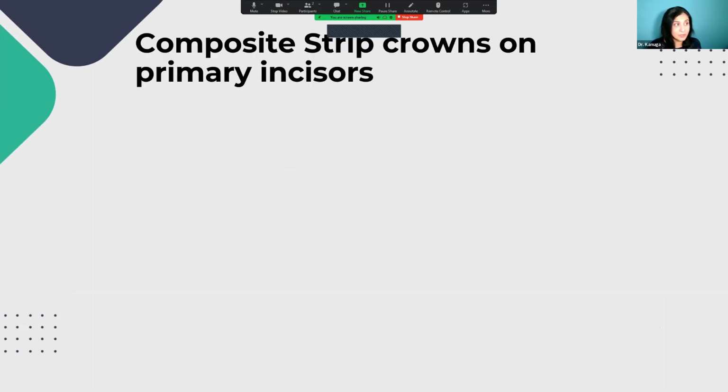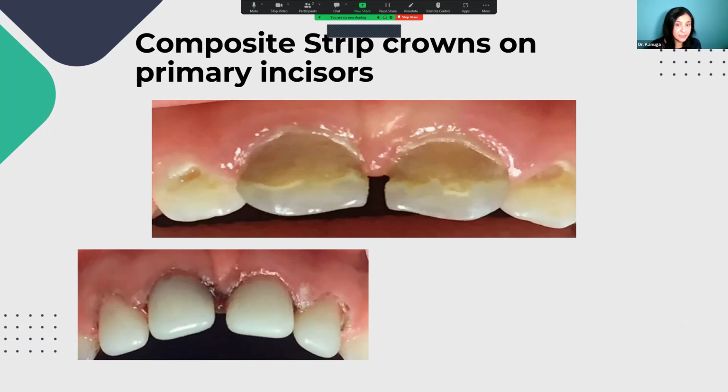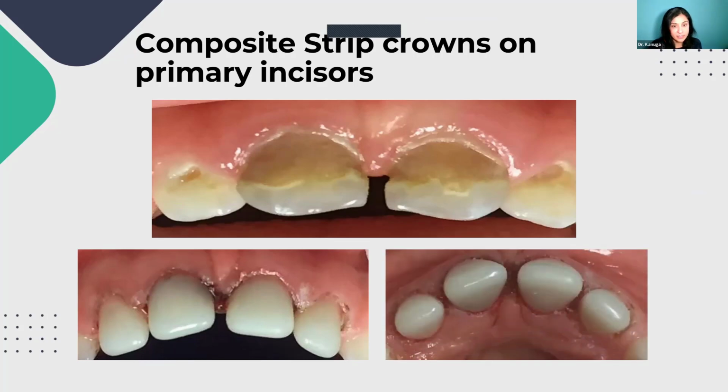And here's a 3-year-old patient. We restored the primary incisors using strip crowns, which are composite crowns, using the strip crown forms. Beautiful Kids SA, Beautiful Packable Composite shade B1 was used here. And this is great results aesthetically. It's very fast. Of course, the aesthetics may not be as superior as the zirconia crowns, but with limited time, resources, and financial limitations, it's a great service to the patients. These composite crowns on the anterior teeth are.